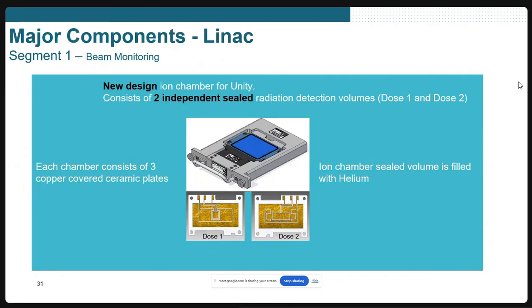The reason being that, because the accelerator is kept at 143.2 centimeters, the accelerator needs to pump in a lot of energy to get a clinically usable dose rate at the level of isocenter. So in order to deliver to that level, the system has to really pump in. If you take this accelerator and put it in a conventional LINAC, it will deliver 3,000 to 4,000 MU per minute, which is quite fast.